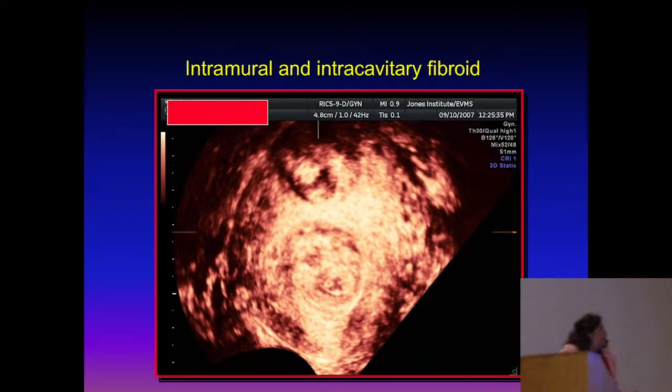So when you have a number of fibroids, we had done this study years ago and presented to AAGL that if you have more than 5 fibroids on 3D ultrasound, then it seems to underestimate the number of fibroids at the time of surgery. But the MRI was not very different, slightly better, but it's really not that different. But I tend to get an MRI for patients who have more than 8 fibroids. Just in some cases you get a better picture.